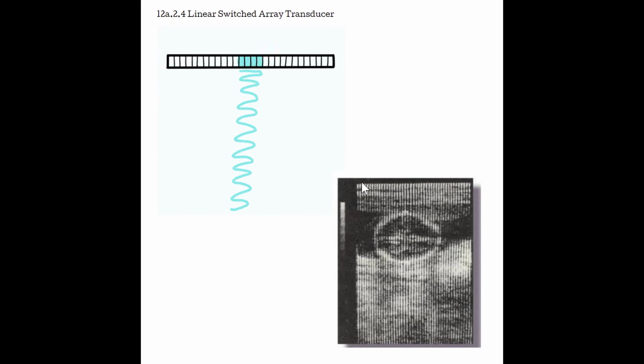Now this image in particular is very, very old. We know that because we are having some gaps in here, so we're losing a lot of our spatial resolution. Notice there are no focal points in here. It is just automatically focused either by the lens that is built into the transducer or having curved elements that are creating these scan lines. And this one happens to be of a fetal head. This is the outside of the head, this is the falx, and this looks like maybe the choroid plexus up in the brain.